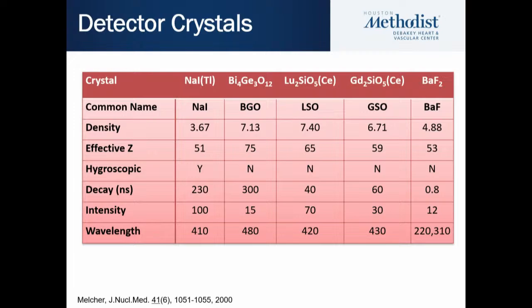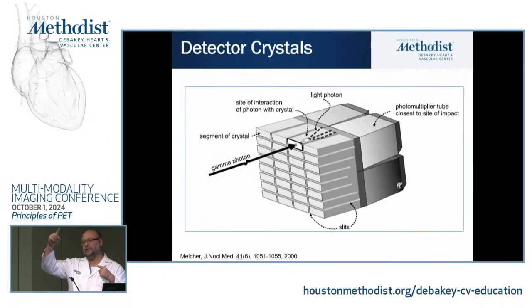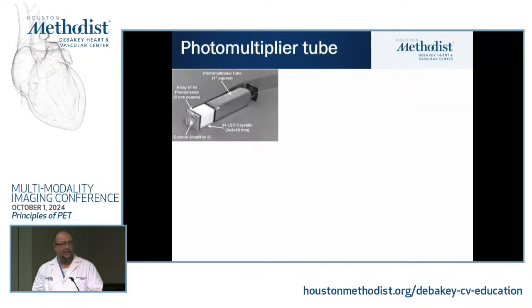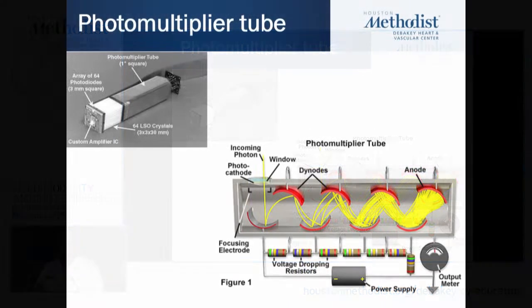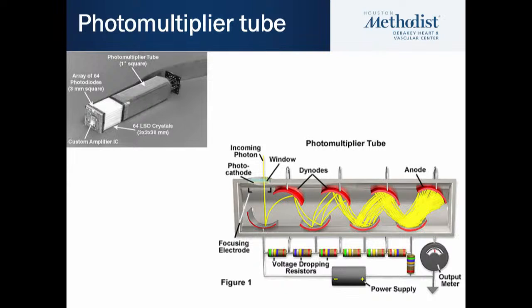So what happens when these 2 photons come and hit the detector? They emit light. These detectors will give a very faint light. Then it goes inside the photomultiplier tube and gets amplified. So it's the name, photomultiplier tube. It's going to multiply it multiple times, and then it will go through electronics, and it will be amplified and processed.